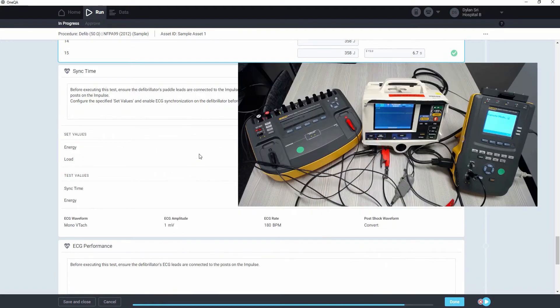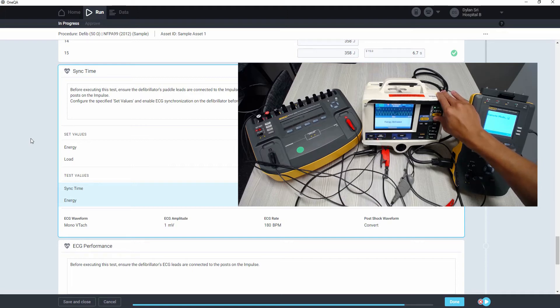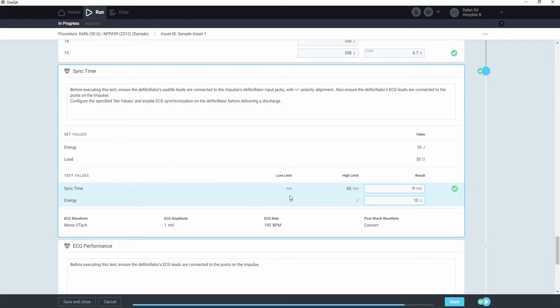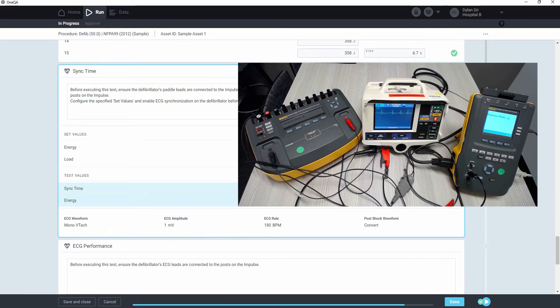Next we'll do the sync time test, which requires the ECG leads to be connected between the impulse and the defib, so that a shockable waveform can be simulated. We start the test by clicking, and that will begin simulating the shockable waveform. Then we'll want to set the energy as specified in the set values, and enable synchronization for the defib. Then we can charge and hold down discharge to send the shock. It passed, and the waveform was converted to the display.